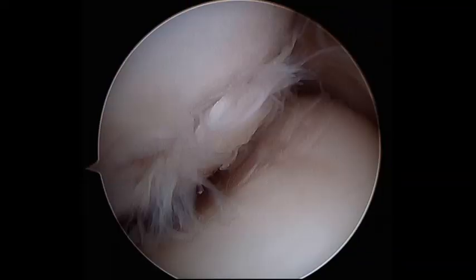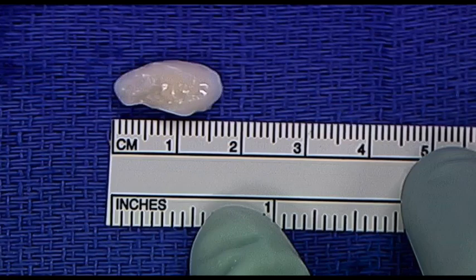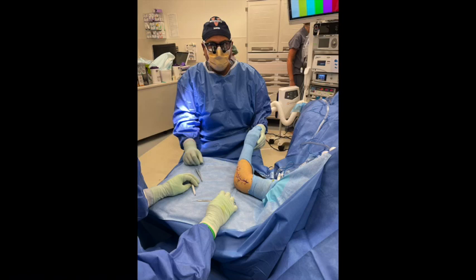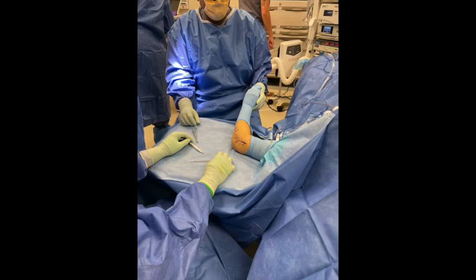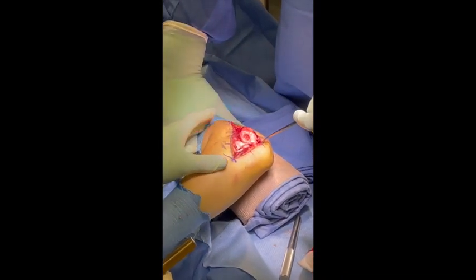The capitellar lesion was visualized and a large loose body was removed from the posterior lateral recess. The patient was then sterilely dressed and drapes were taken down. She was transitioned to a supine position with the operative extremity exposed on a hand table, and a large extensile lateral approach using an extensile Kocher approach was performed.